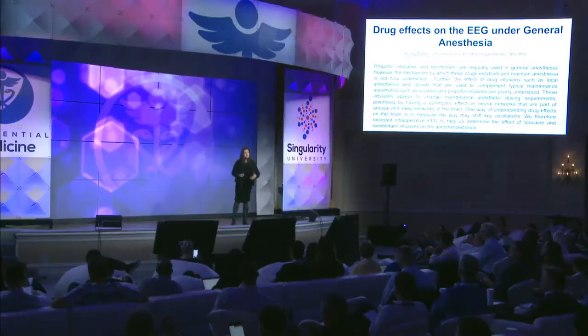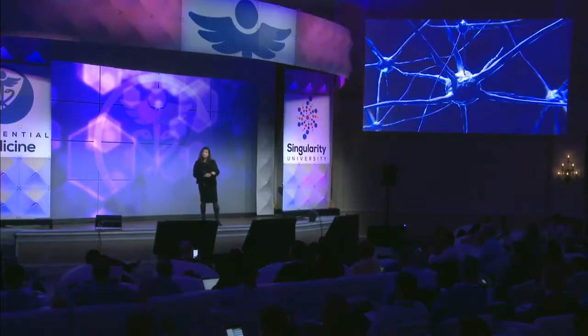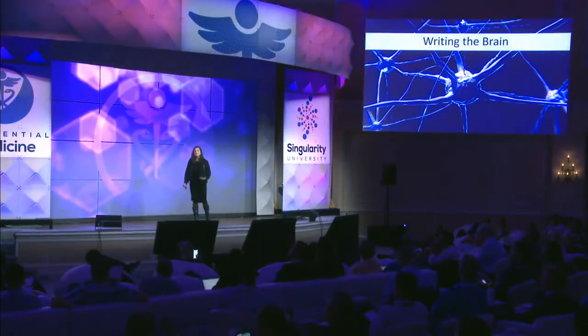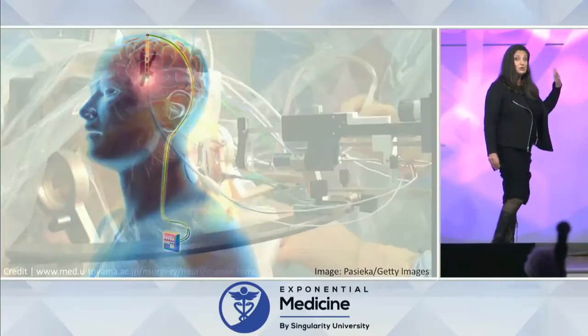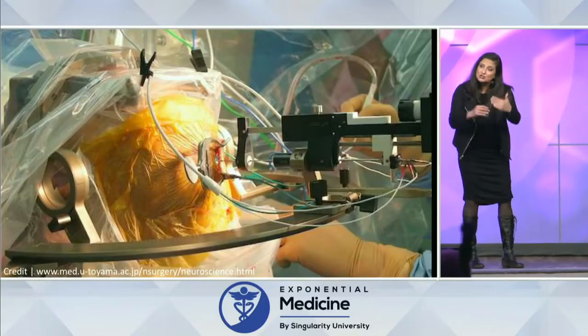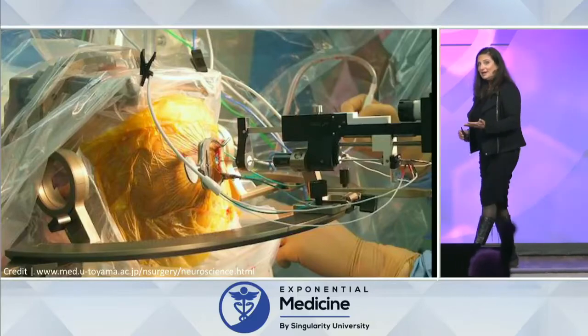And you're going to hear a lot more about it this morning from Ariel and from Mary Lou Jepson. But let's go on to writing the brain, because what I'm here to tell you about is where the cutting edge is going. Now, many of you are familiar with this. This is deep brain stimulation. It's an older technology whereby we put electrodes into people's brains and inject electricity into the brain in order to control circuits that have gone bad.